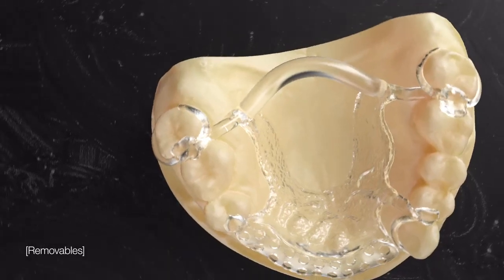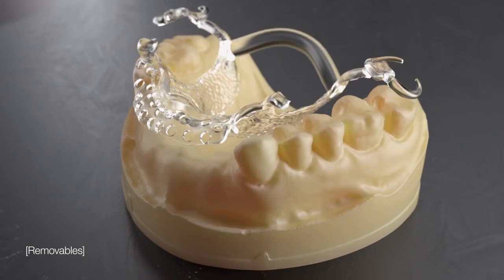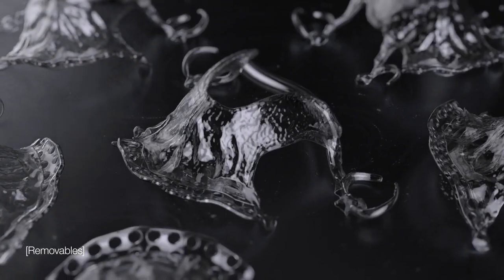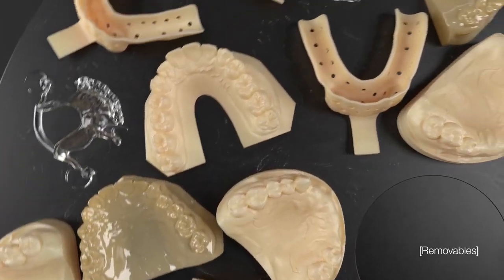Outperform traditional dentistry and automate the process of cast chrome partials. Reduce patient visits and resets thanks to highly precise printed frameworks that can be printed with models simultaneously.